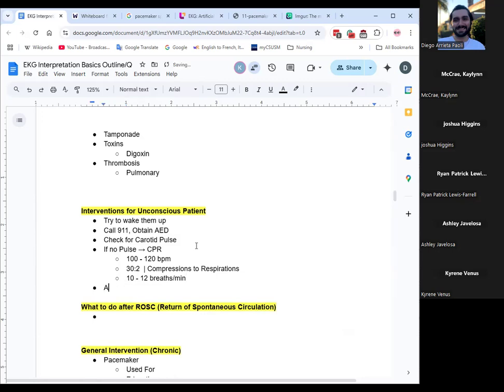All right, so now let's talk about when they actually get the AED. The first step with an AED is turning it on. True. So when the AED is on and the rhythm is checking, what do you have to do? Listen to instructions. We just did our ACLS class this past month, and the lady was literally like, just turn it on and listen to it. It's telling you what to do, with pictures. You can't miss it.